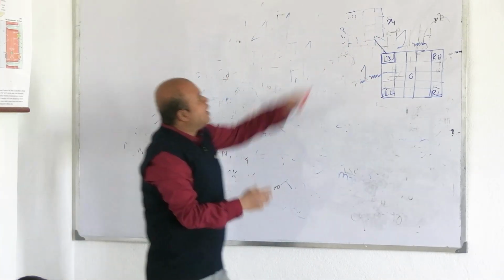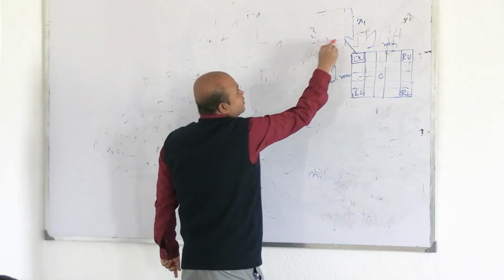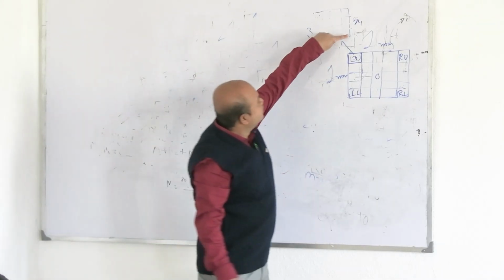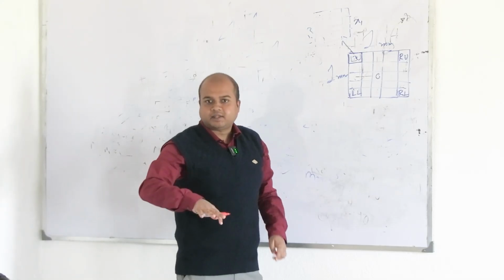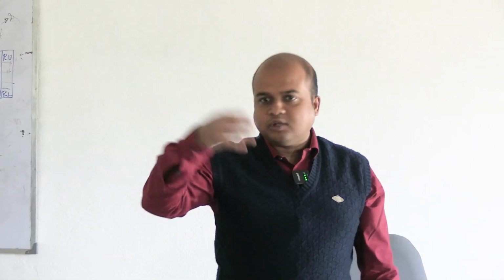So, see, actually we have counted this whole thing. Okay. So, what is left out? This margin and this margin of the medium square. Count it at the last. I think in books it is not mentioned. Count it at the last. It will be more accurate actually. Few cells will be in this margin of the medium square also.